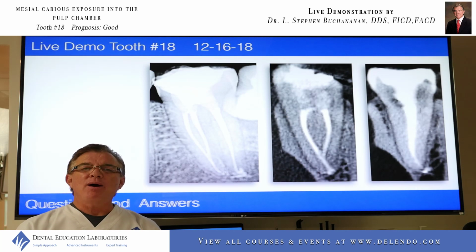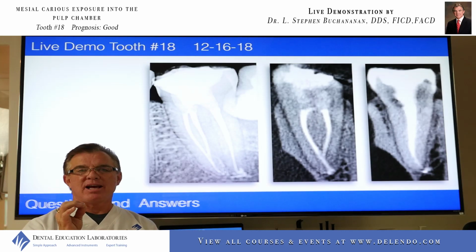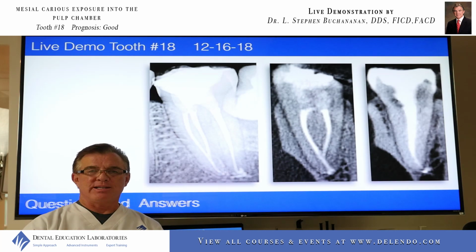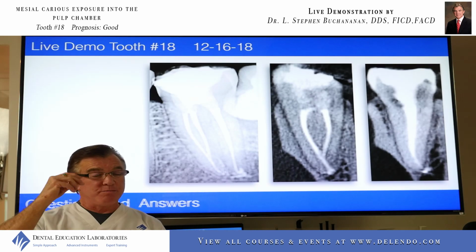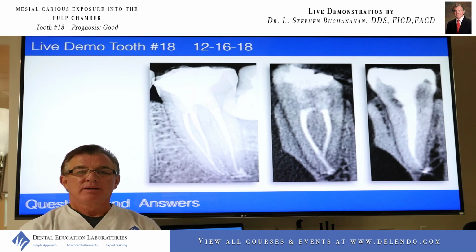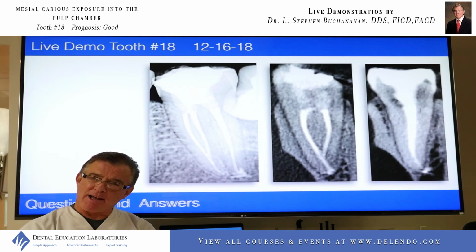What we can do now, however, is literally just by cementing the cone in single canals that are in single roots, you're going to fill almost every lateral canal that is in that root. When you get to mesial roots of lower molars with a big wide isthmus, MB roots of upper molars, they have quite a rich network of laterals and loops and fins and hoopy-doos. I feel like I need to downpack those further.